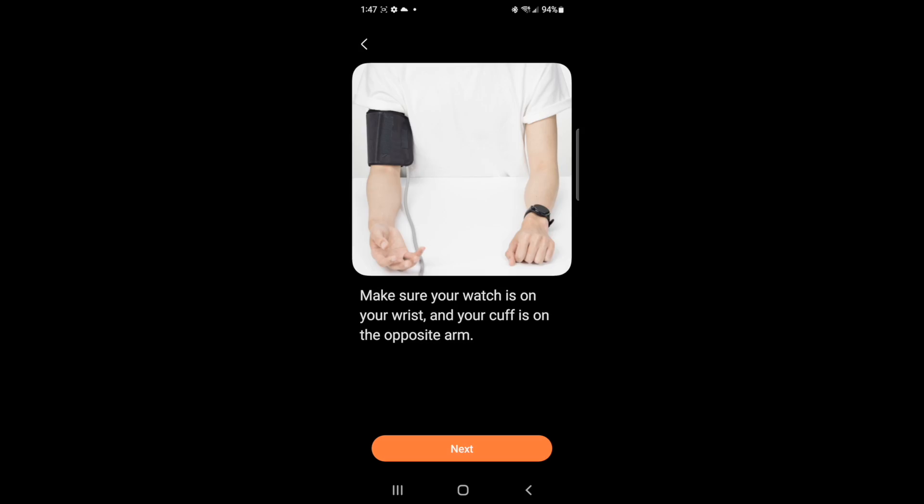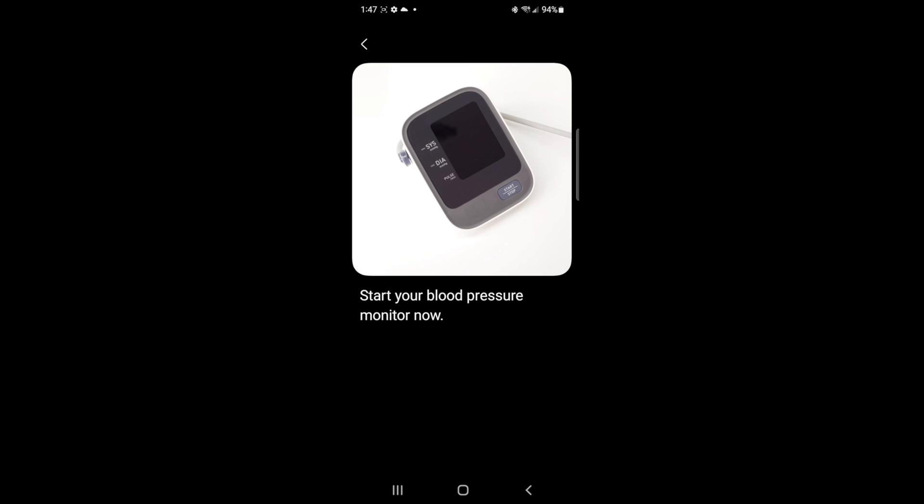The blood pressure monitor was the thing I had the hardest time with. I initially could not get it to recognize the watch, even though the ECG worked perfectly fine and linked up. The BPM did not work initially, but I finally got it to work with some help from Samsung, and it was a fairly easy process to calibrate it. Bear in mind also that you have to do this calibration process every 28 days for the blood pressure monitor in particular — every 28 days you've got to go through the whole process again just to keep everything fresh and make sure it's working properly.